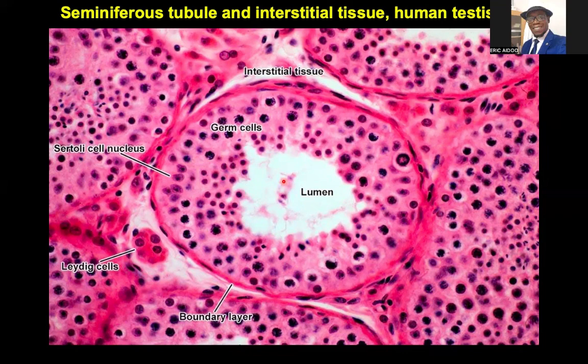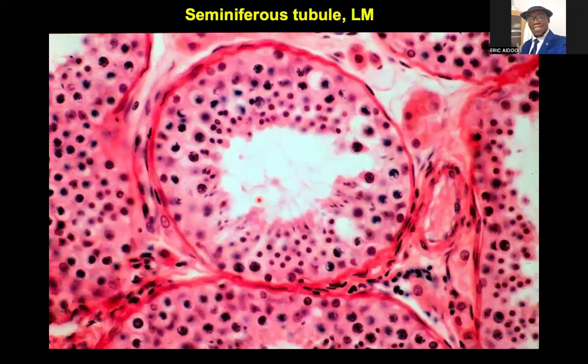So it means that the mature cells will be closer to the lumen. That will be more of the spermatids. The tails that are prominent are found within the lumen. You can now see very beautiful tail-like, thread-like structures. All these are the tails of spermatids.